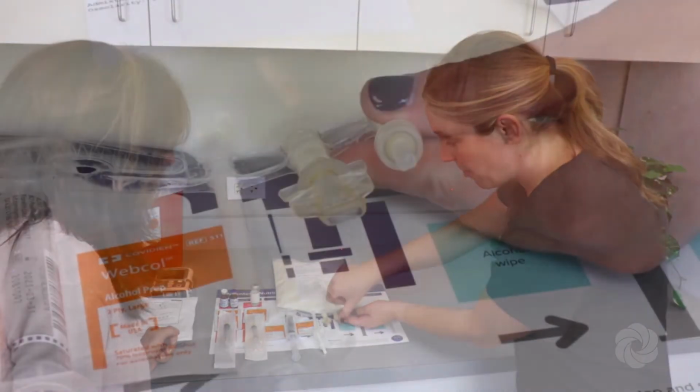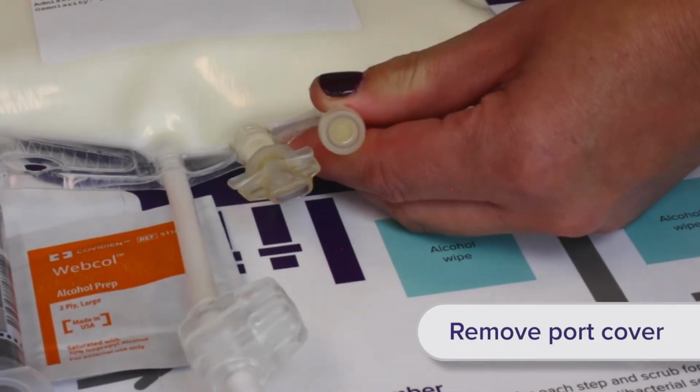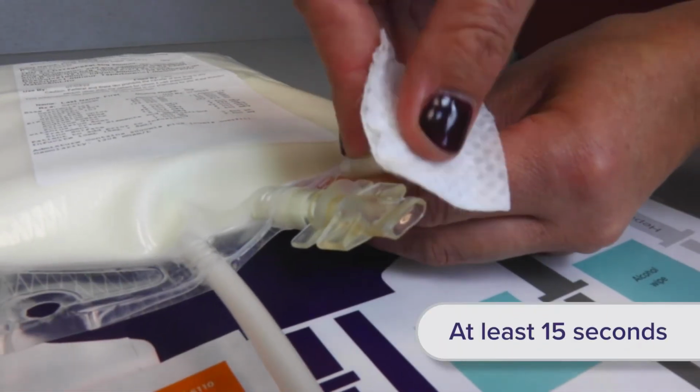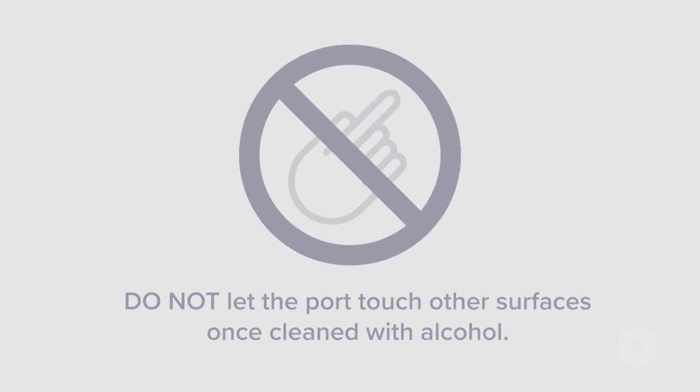Locate the injection port on the PN bag. If there is a cover over the port, remove it. Scrub the end of the port with an alcohol wipe for at least 15 seconds and allow to air dry. Do not let the port touch other surfaces once cleaned with alcohol.